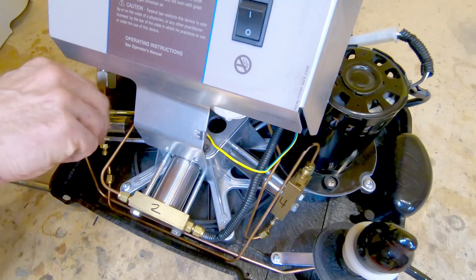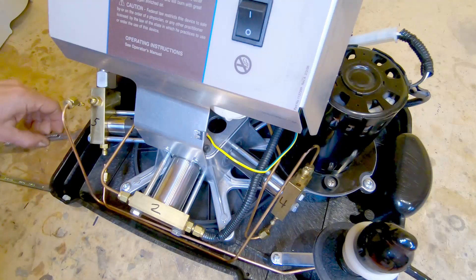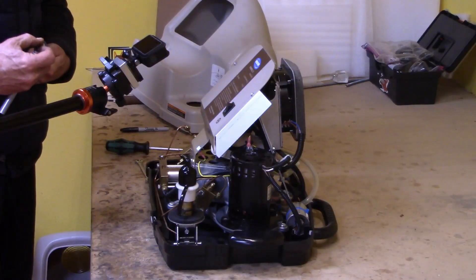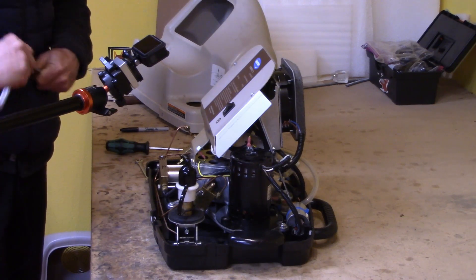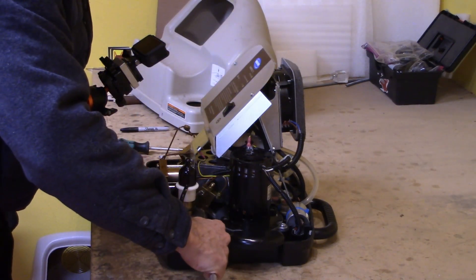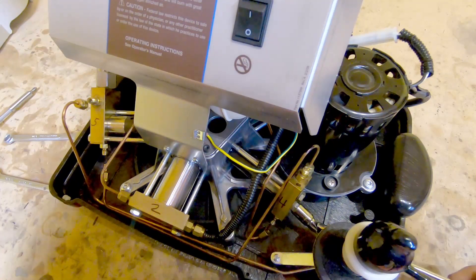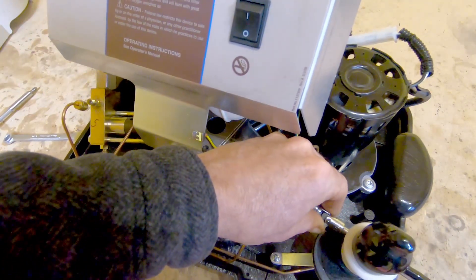It's a fairly simple device and there's nothing that's super tricky for somebody with mechanic skills. Anybody who's ever worked on or rebuilt a motor should have no problem with this. But if you don't trust your mechanic skills, you should probably not attempt this. And definitely, if you're depending on it for being able to breathe, don't work on it yourself.